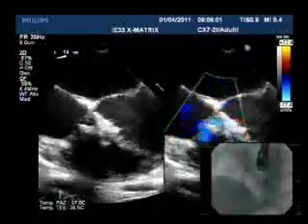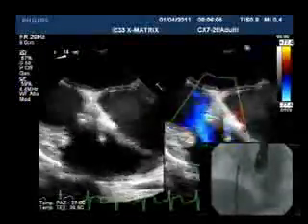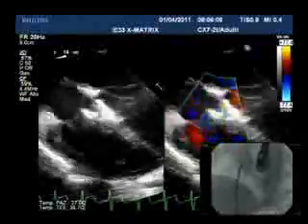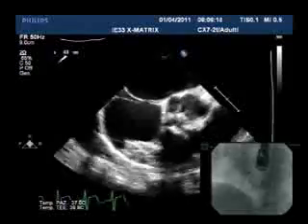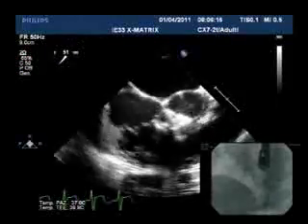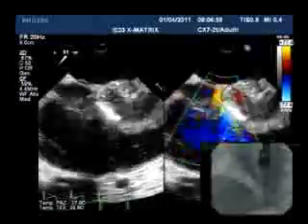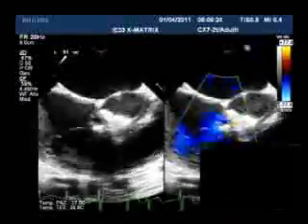Okay. There is no major interference with the tricuspid valve. There is probably a small residual leak. So we do an angiogram here. Step on forward for a second. Mario, we've got 1 minute with you. Okay, we'll do an angiogram. Okay, go ahead. And show us the angio large now.